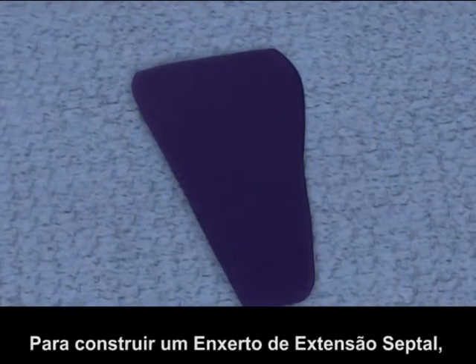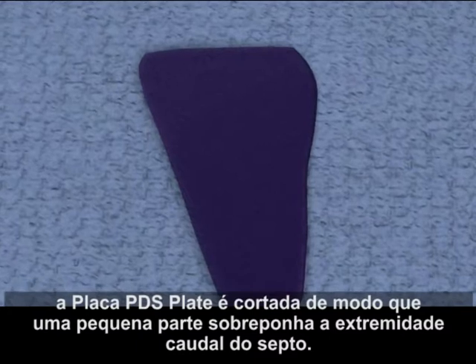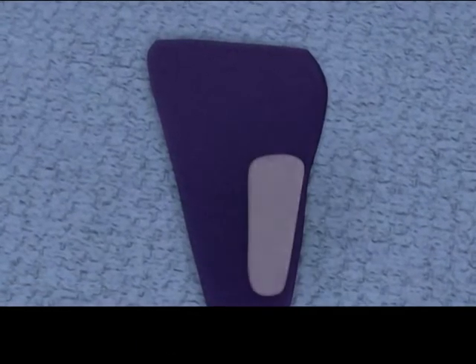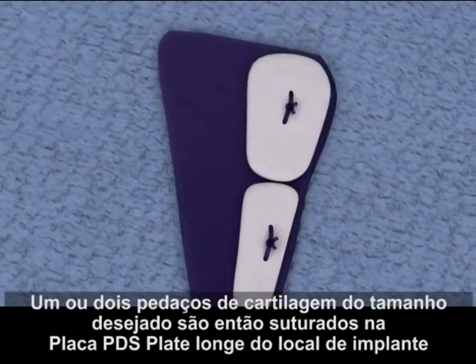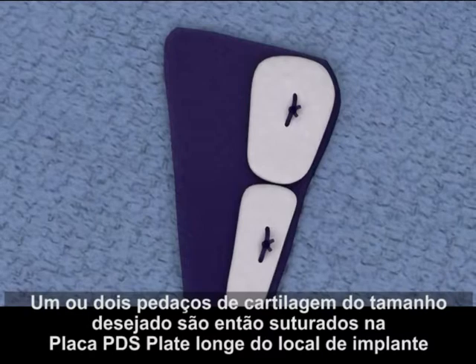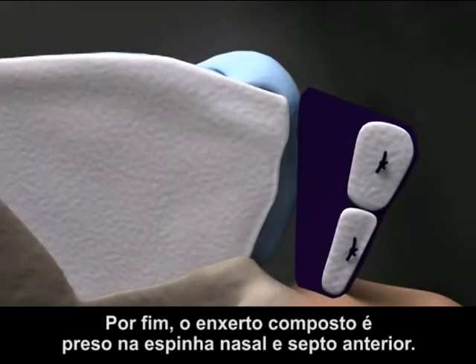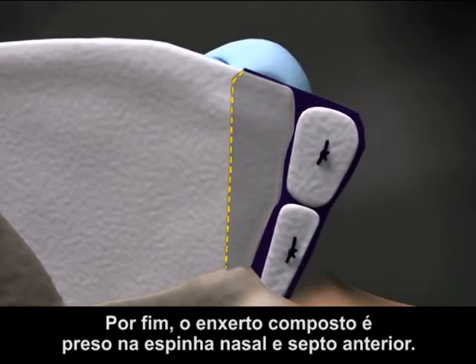For constructing a septal extension graft, the PDS Flexible Plate is trimmed so that a small section will overlap the caudal end of the septum. One or two pieces of cartilage of the desired size are then sutured to the PDS Flexible Plate away from the implantation site. Finally, the composite graft is secured to the nasal spine and the caudal septum.